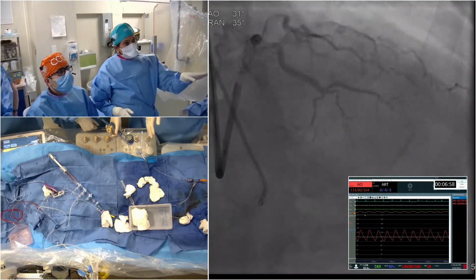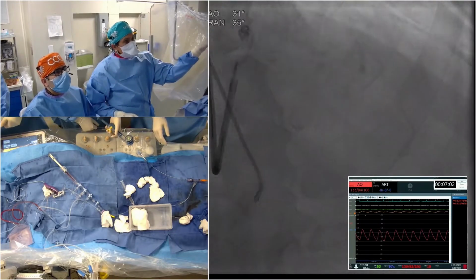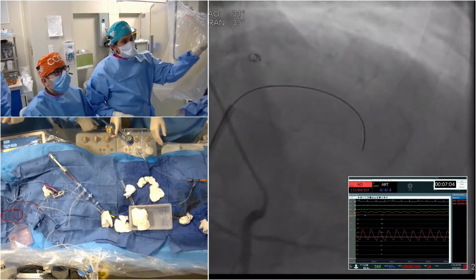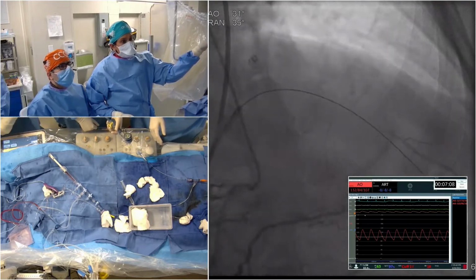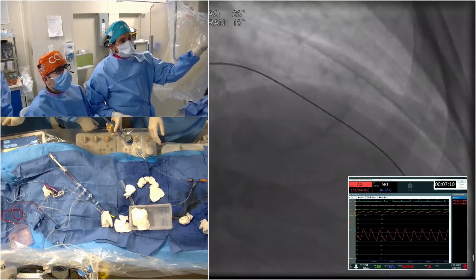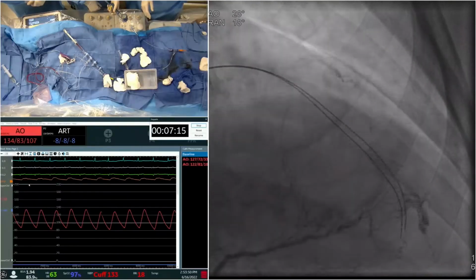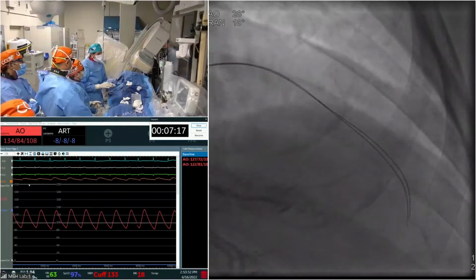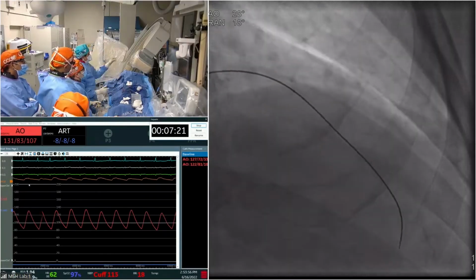Then Gaia took us on the upper surface, came back, and when we entered the proximal cap, this is where we were after we re-entered with the Confianza. Same Confianza wire, Pro 12, pulled back, successful wire. Excellent, with the Confianza 12.